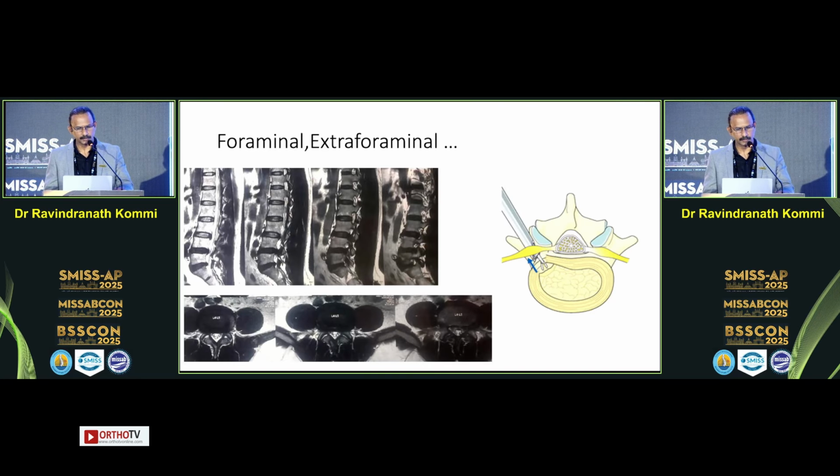Now, coming to the extraforaminal disc, you find the L4-L5 disc, and you land on the lateral pedicle line. You put your instruments in, and the disc fragment is right in front of you. You just have to remove it without causing any tissue damage or any bone resection. The patient is comfortable under local anesthesia. You can get him down from the operating table and make him walk as well. So that's so easy. It's like going to a dentist, finishing your work and going back home.